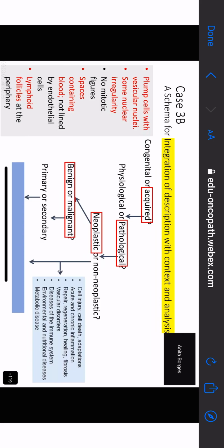It is recurrent in an 8-year-old child, and there is only one tumor. If you had put all this into your Google, you would have known exactly what it is. And this is an angiomatoid fibrous histiocytoma.